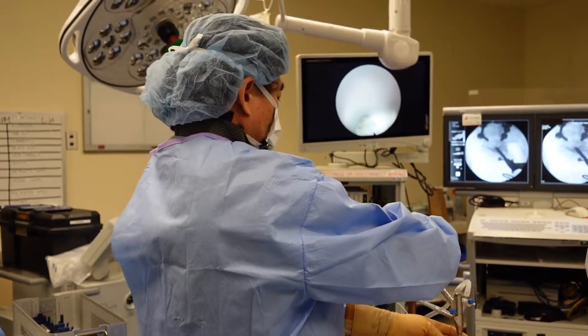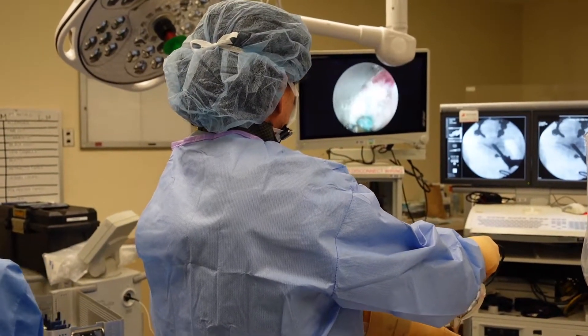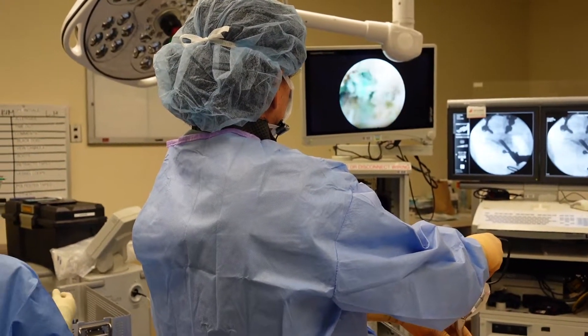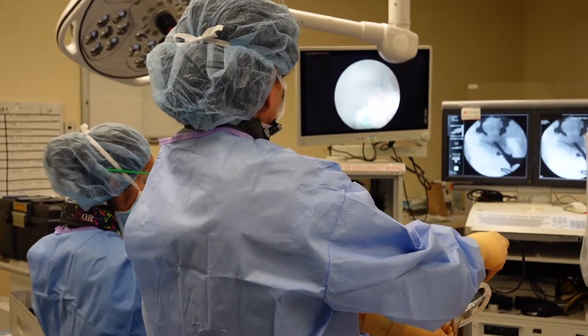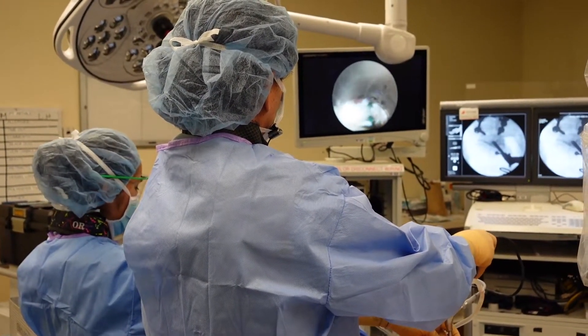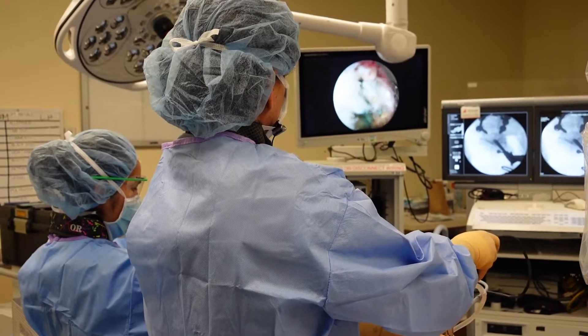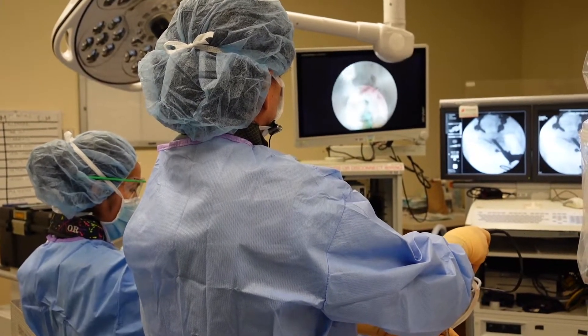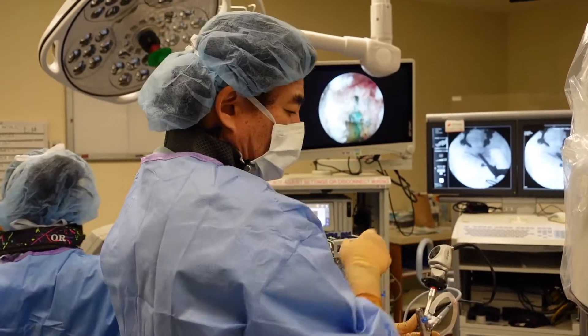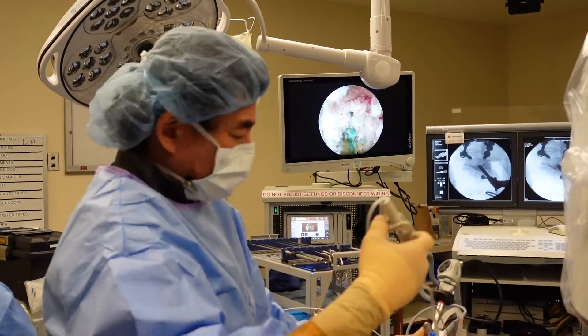That looks good. Now I'm going to look totally toward me — that's lateral, away from the canal. That's where the exiting nerve root goes out. That's not your problem, but if it was, that's how I would deal with it. You can see the little bone shavings that we made with the serial reamers.